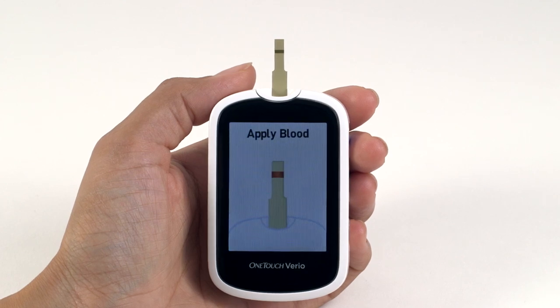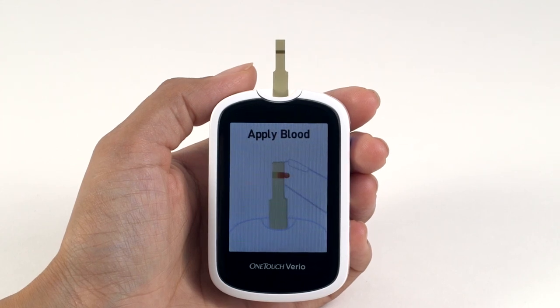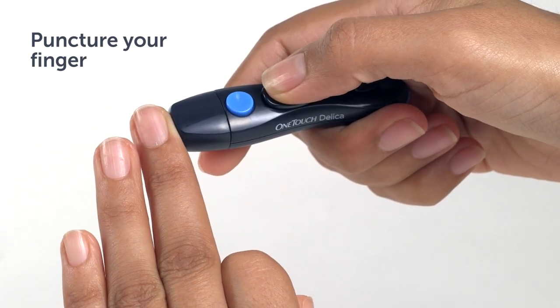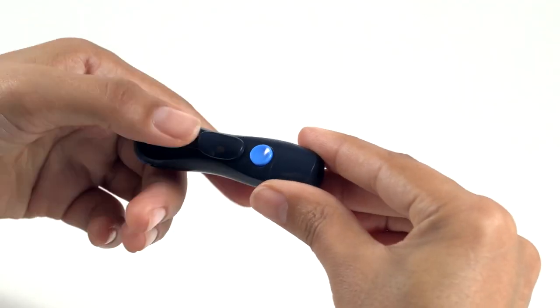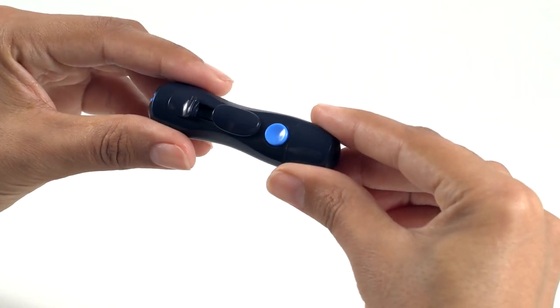When the Apply Blood screen appears on the display, you can apply your blood sample to either side of the test strip. Hold the OneTouch Delica lancing device firmly against the side of your finger. When you're ready, press the release button to puncture your finger. Remove the lancing device from your finger. The OneTouch Delica lancing device incorporates an advanced glide control system, providing reduced vibration for smoother lancing.